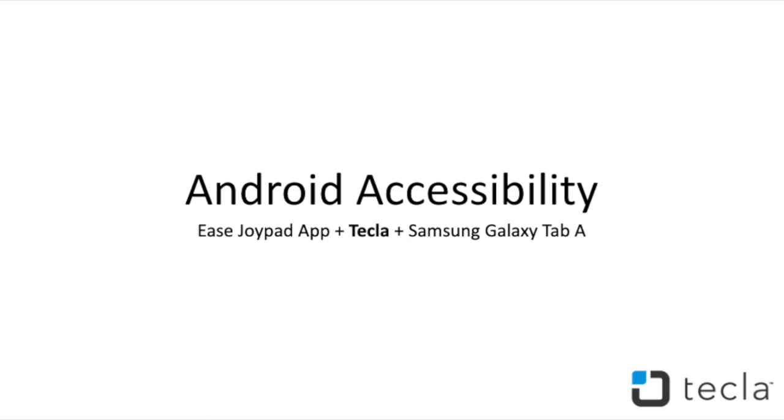Hello Tecla Insiders! This month we will be showing you how to control your Android using the Ease Joypad app and Tecla.